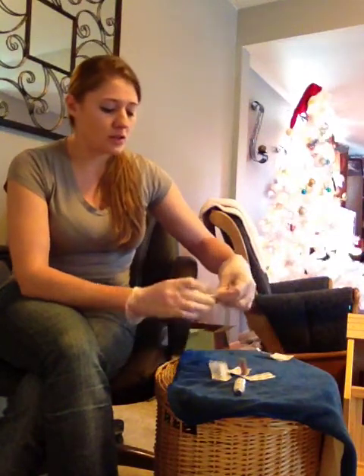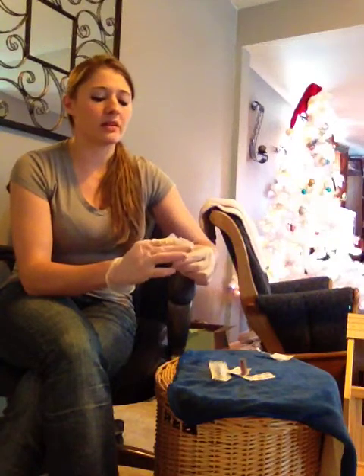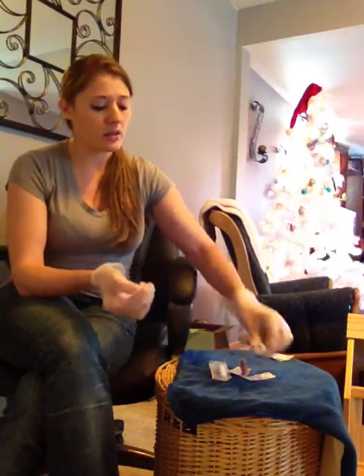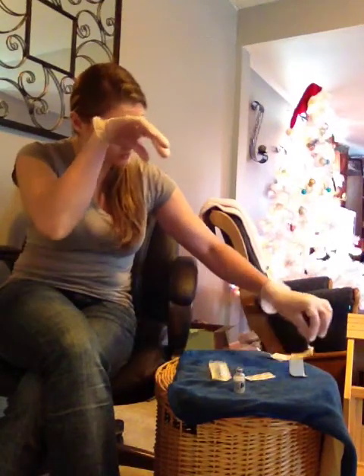The first thing that you'd want to do is clean your vial, because there's going to be bacteria that harbors on the top of this vial, so you're going to want to clean that for about 10 seconds with an alcohol swab and discard that swab.